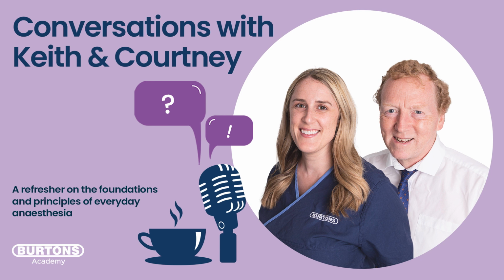And things aren't going to go horribly wrong. The blood pH isn't going to swing so fast that everything goes to mush, in terms of protein lysis and all those sorts of things. So it's not drastic. You just change the respiratory rate again and pull it back. And it's very responsive. If you've got a steady state condition in the patient where it's not febrile or hypothermic or there's nothing untoward going on, you change the minute volume and the end tidal CO2 will change. It's an unassailable fact. Those two follow each other. So that's kind of how we're going to use capnography to control our ventilation.